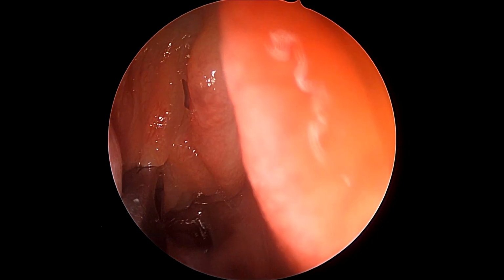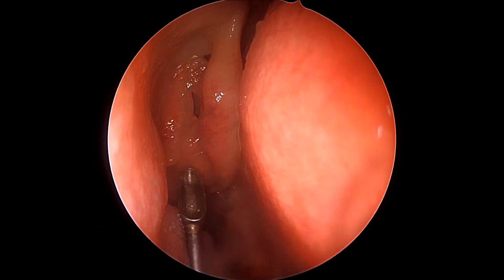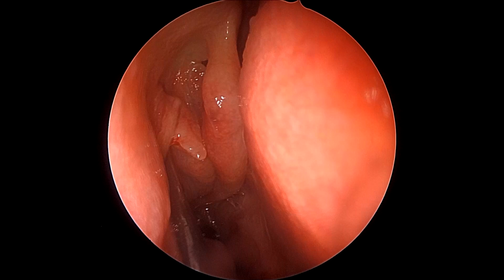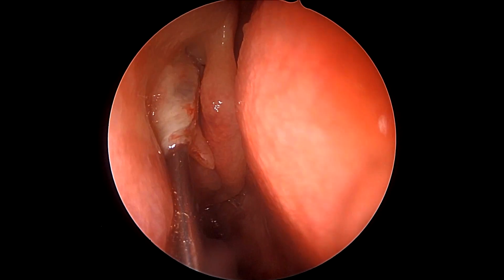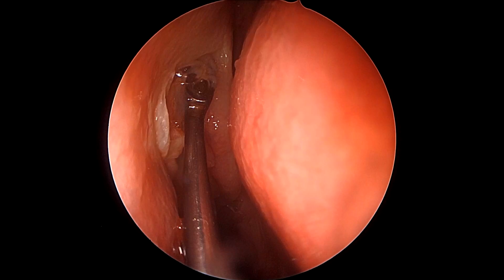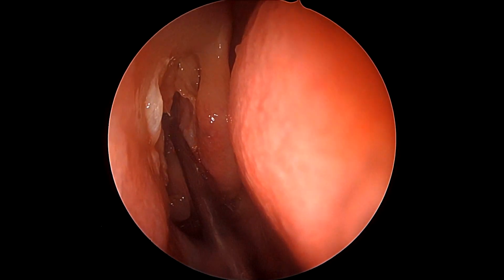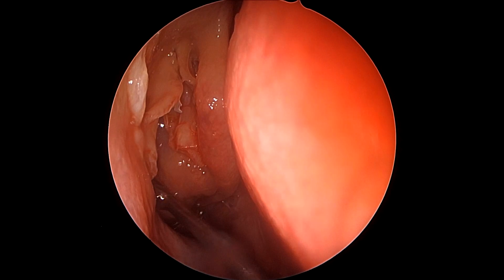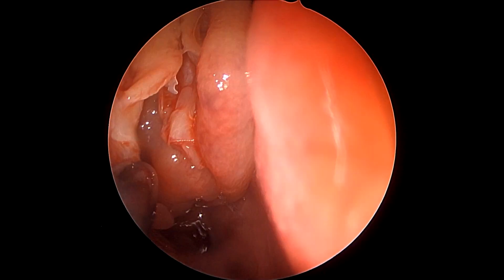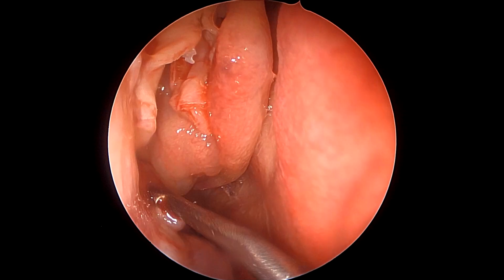uncinectomy in a standard way using a backbiting forceps. This is a standard technique. We do not endorse using a sickle knife. Then by using a frontal sinus curette or a good quality strong ball probe, we can just back fracture the uncinate process, flush with the lateral nasal wall. And since the frontal sinus is in question in this patient, the uncinate process has to be removed right till the superior part of it.